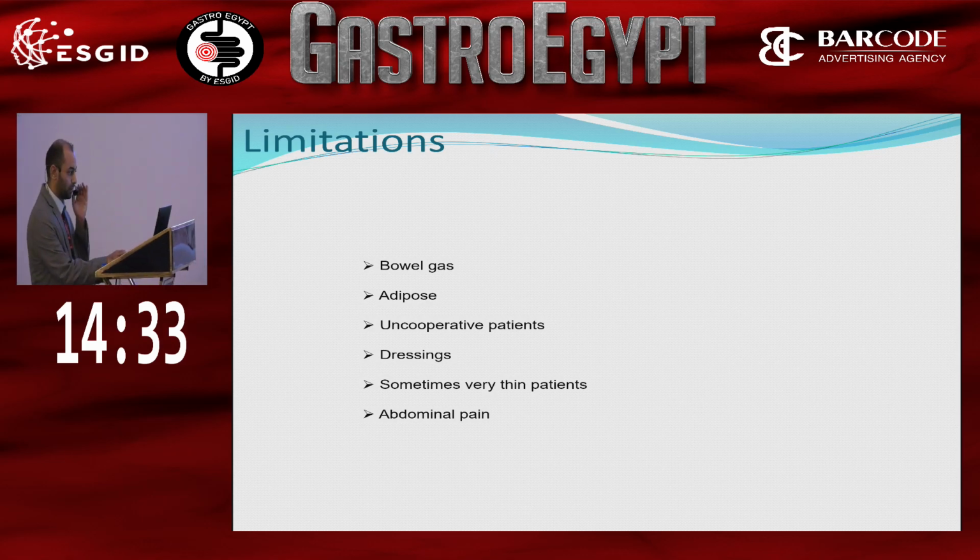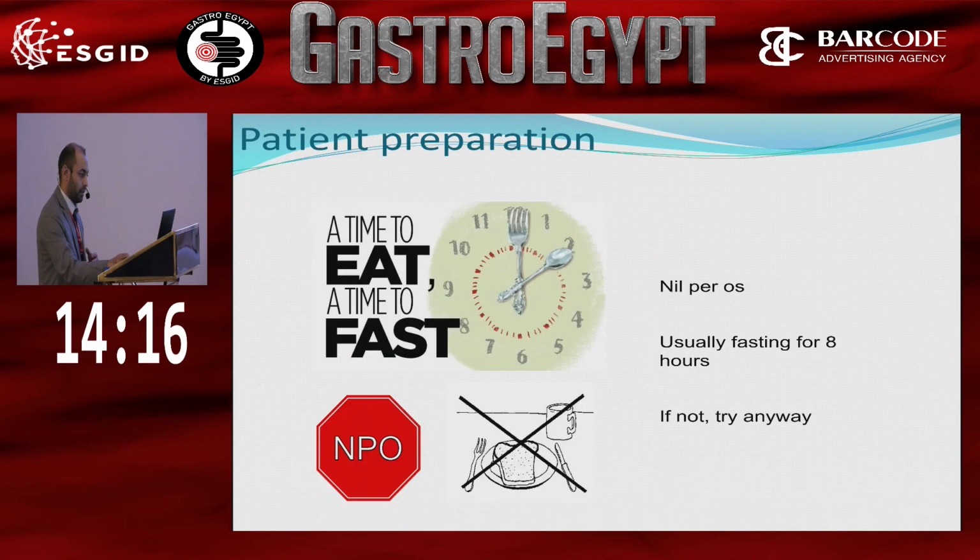I have some limitations in ultrasound. First, bowel gas, fat people, adipose tissue, uncooperative patient, dressing or bandage. Sometimes, in a thin patient, it may be difficult to have an ultrasound examination. Preparation: the patient has to fast for 8 hours.